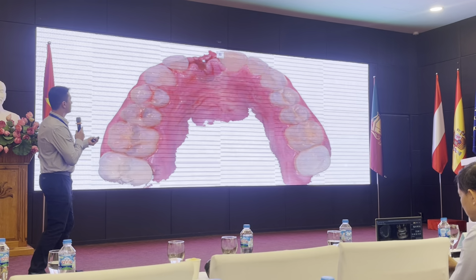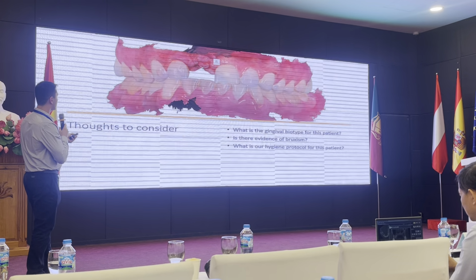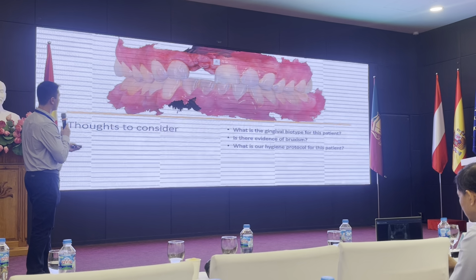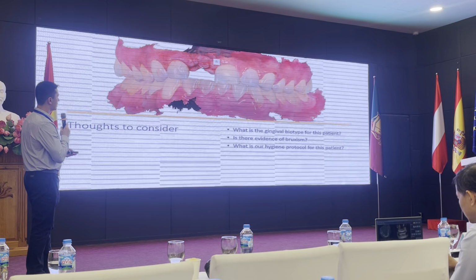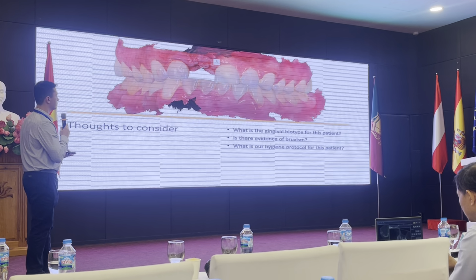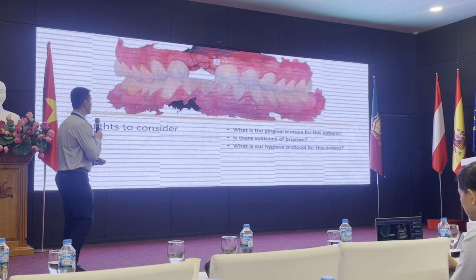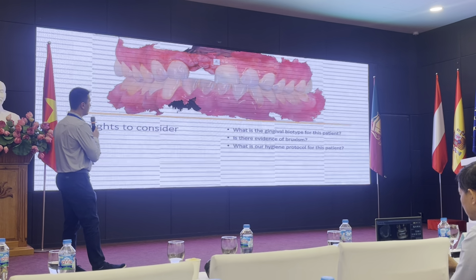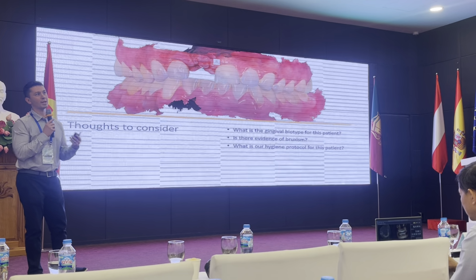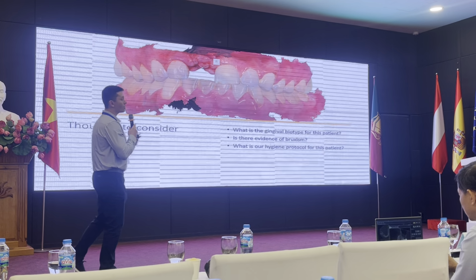This is our scan. We have our scan body there. And we have to consider a lot of things when we're restoring this. You know, what kind of gum tissue is there? What is the gingival biotype? Does the patient brux? Are they grinding their teeth? And do we have a hygiene protocol established for this patient so that he can maintain the health of his implant?